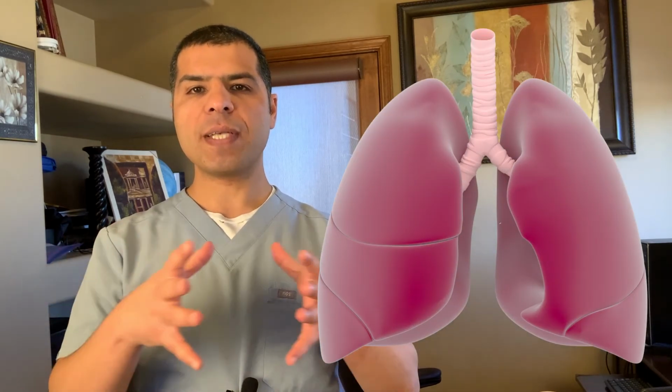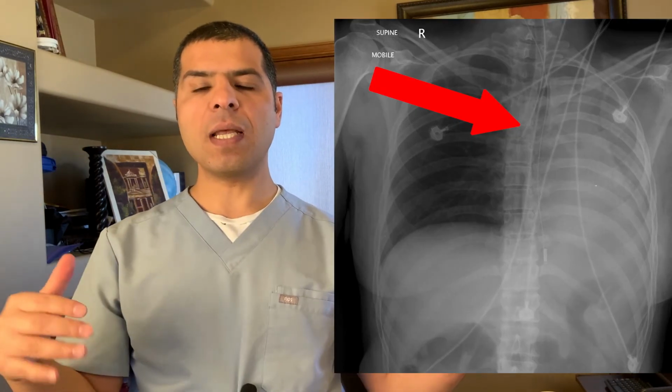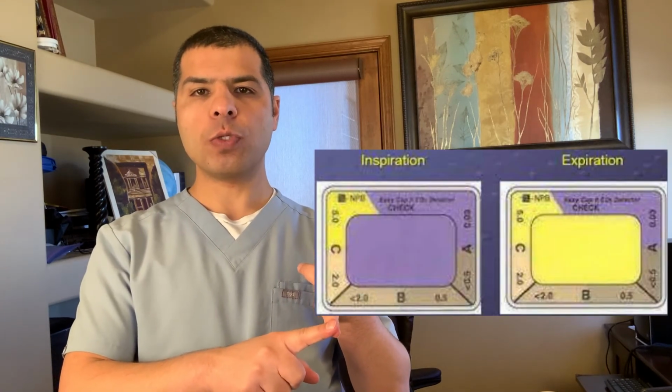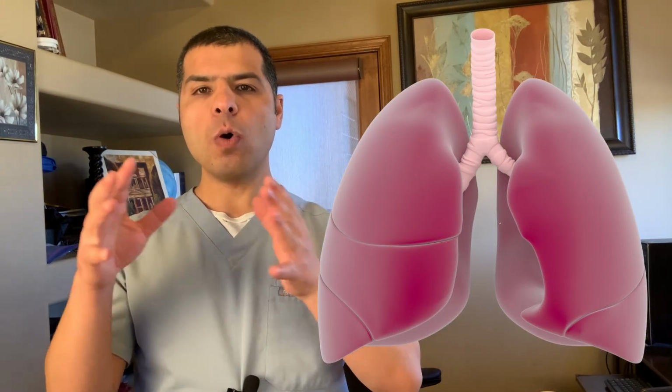Breath sounds have to be equal on both sides. If breath sounds are not equal, suspect right main stem intubation. So simply pull the ET tube back by 1 centimeter and listen until you get equal breath sounds. Very important that you get equal breath sounds. At that point, you have appropriate color change on the CO2 detector, the capnography, for 5 breaths, and equal breath sounds. Only at that point, I tell them to secure the ET tube with a tube holder. And then after securing the ET tube, they will connect the patient to mechanical ventilation.